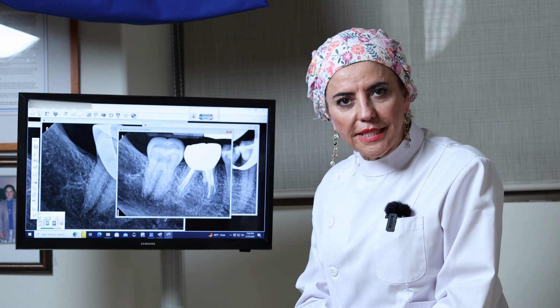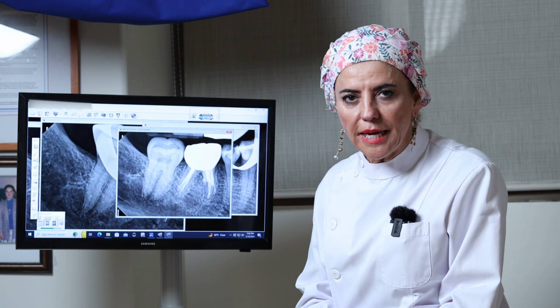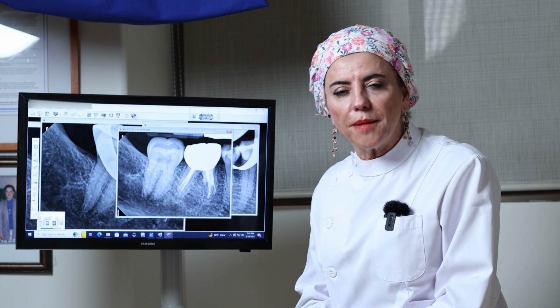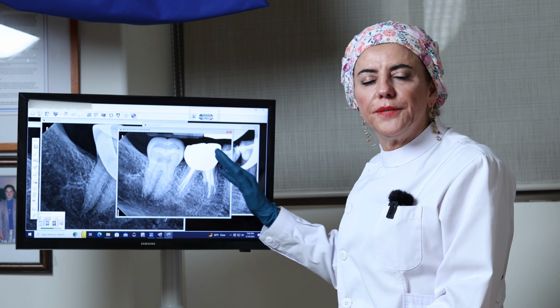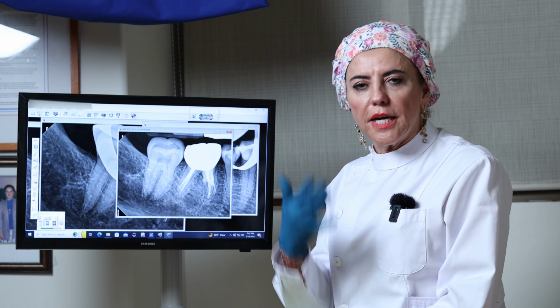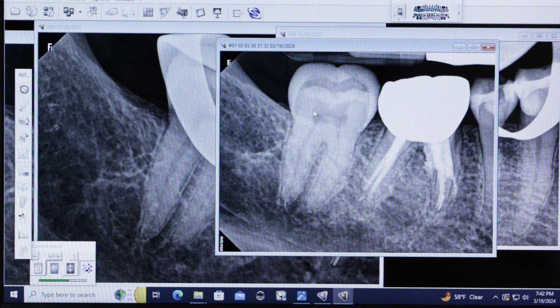But I hope you like this episode, and I hope you learn. It's a broken instrument and it happened during a root canal. It's not a problem if the canals were irrigated and fully filled. Fill the canals with gutta percha and cover the perforations with MTA.